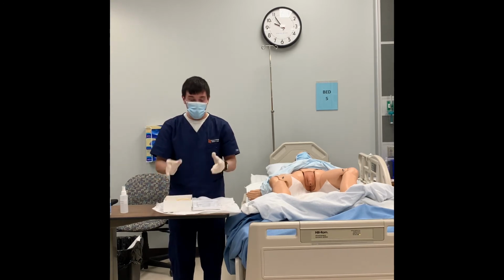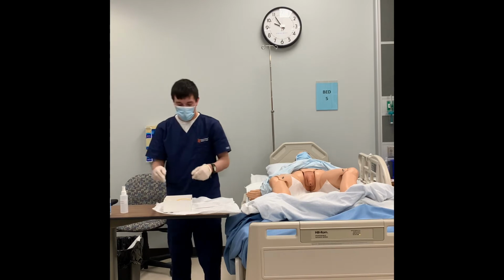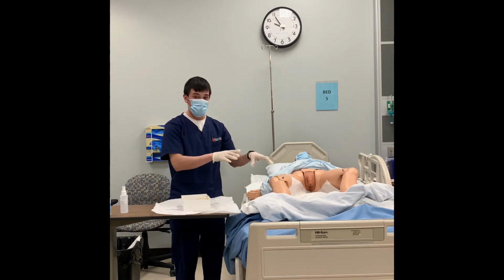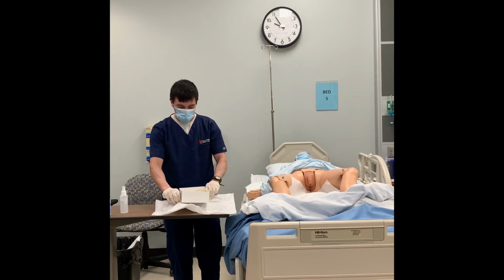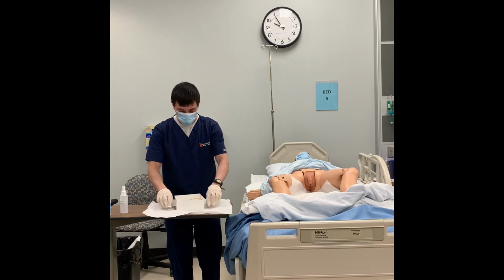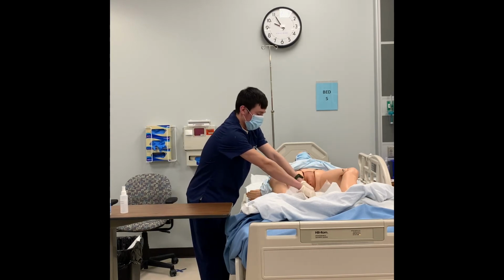And now I have everything set up in this box. So I no longer need this. So go ahead and toss it, throw it away, and now I can adjust my box. And now everything is in my box, so I'm going to pick it up and take it to the field, so I no longer have to move it around. So pinching the inside, make sure that I'm not getting anything that I shouldn't. And now I'm going to take it. Okay, so now I'm going to go ahead and adjust it there.